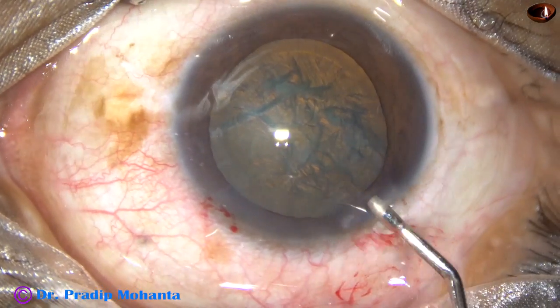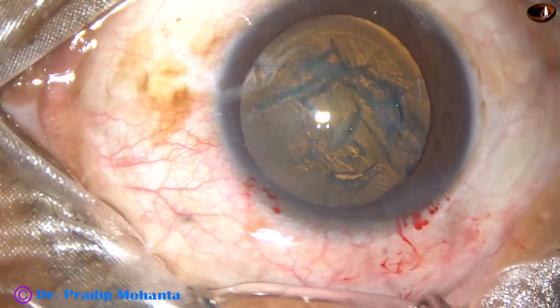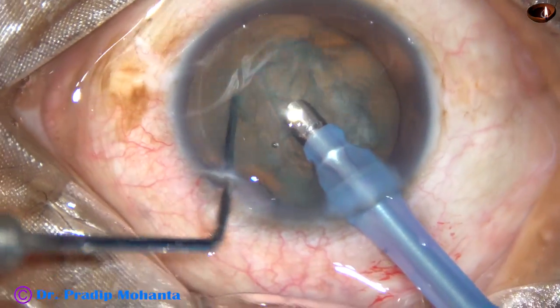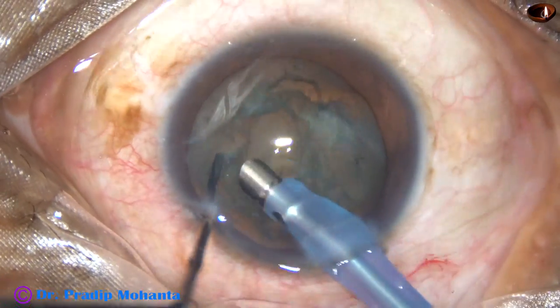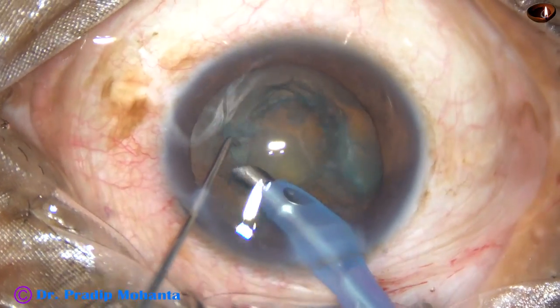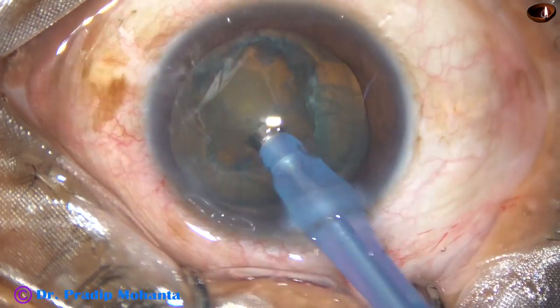Some more visco is added, and then the tip of the phaco handpiece is introduced into the anterior chamber. Some superficial cortical lens matter is removed. In this case, I attempted the carousel technique, but it didn't work. So I am trying mechanical chop now.